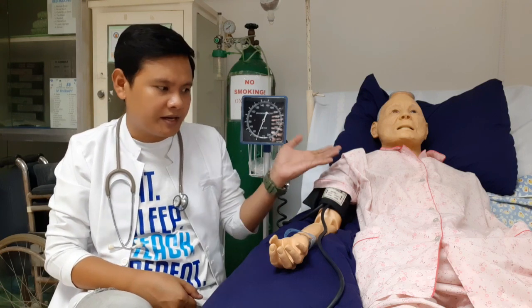What else? We have to place the client in the appropriate position. As you can see here, yung pasyente ko is nasa semi-Fowler's position. So, kailangan pa po ba siyang ipunta sa sitting position? No need. Kung ang pasyente natin is comfortable sa ganitong position, hayaan na natin. Okay? What else? Kung ang pasyente natin is nakatayo, definitely, paupuin natin para mas maging relax yung pasyente natin. Ano pa?